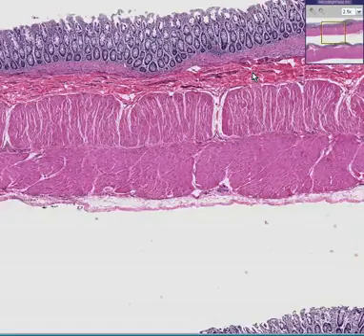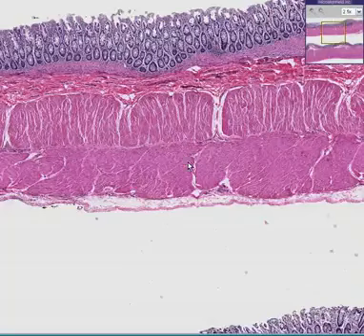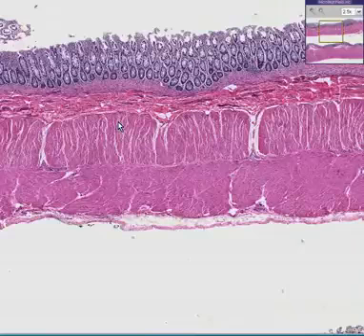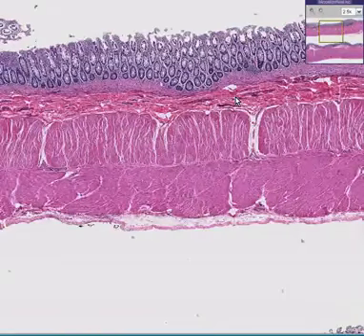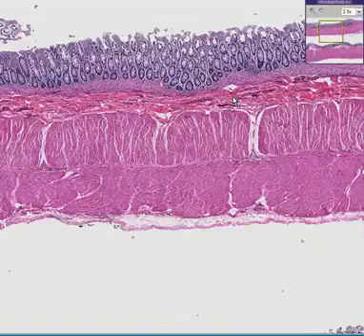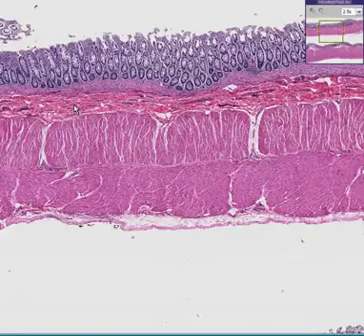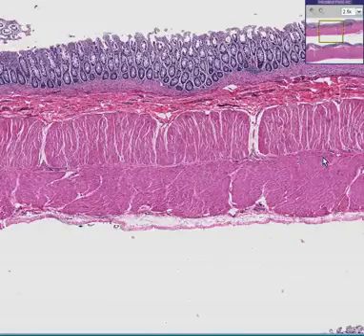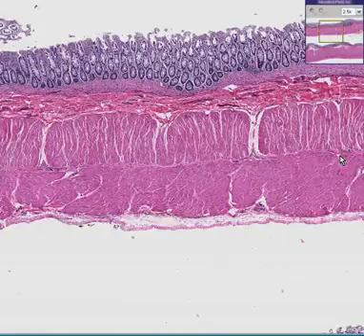We could look if you want, but you're not going to find any here, because this is a patient that does not have them. This is a congenital disease. The congenital absence of both Meissner's submucosal as well as Auerbach's myenteric nerve plexus is called Hirschsprung's disease.